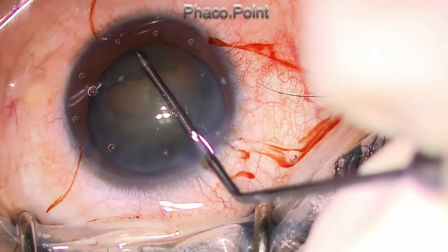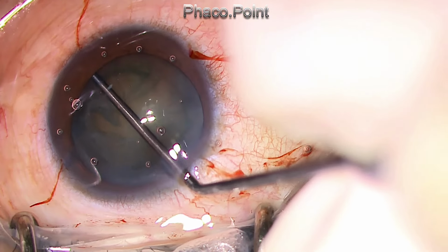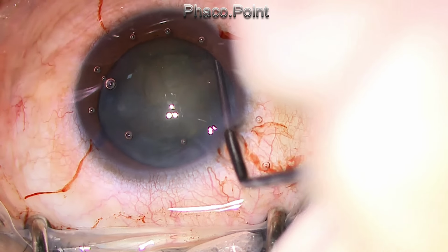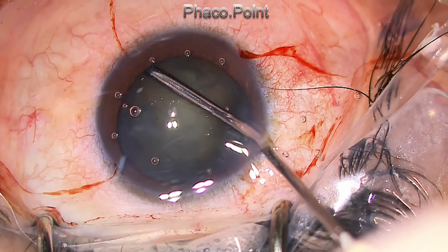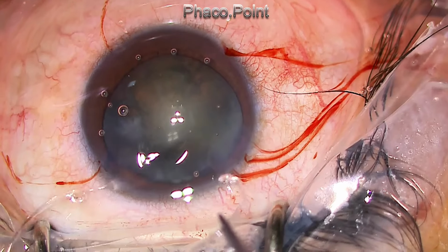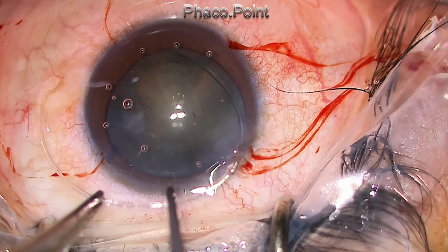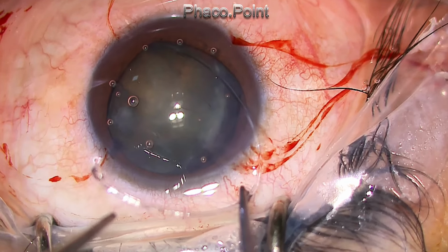I create a small mechanical separation between the anterior capsule and the superficial cortex using a rod to sweep in that area. After which I will create further space in that particular region by putting in methylcellulose, and then I'm going to attempt to put the CTR just before I even start the procedure. Well, this is my practice, that when I see a zonular dialysis, I always put the capsular tension ring first. There is of course a great apprehension that while attempting to do so, you may actually make the dialysis worse because the tip of the progressing CTR can snag the lens capsule.